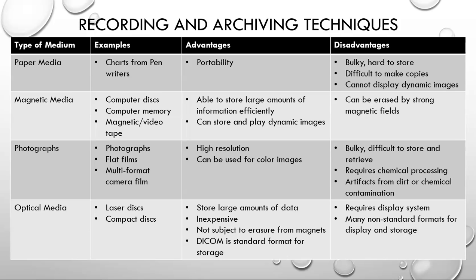DICOM is the standard format for storage on laserdisc, compact disc, or other hard drive material. These require, however, a display system. There are many non-standard formats for display and storage.